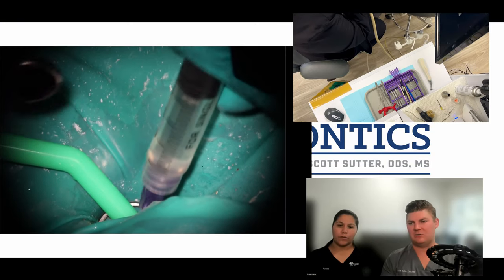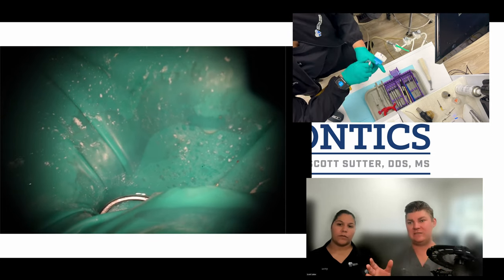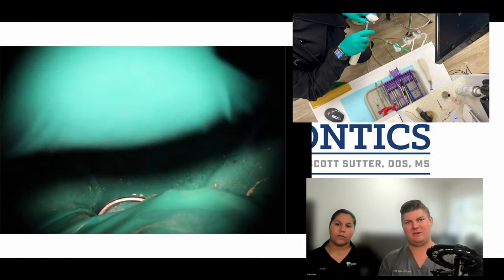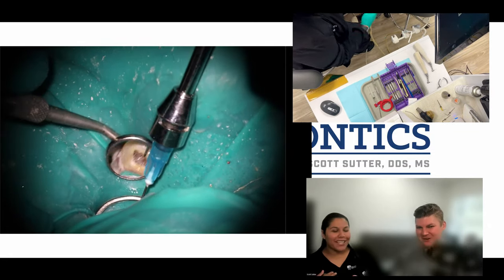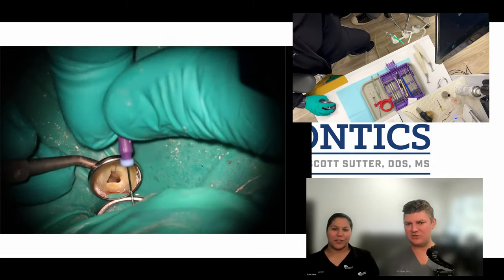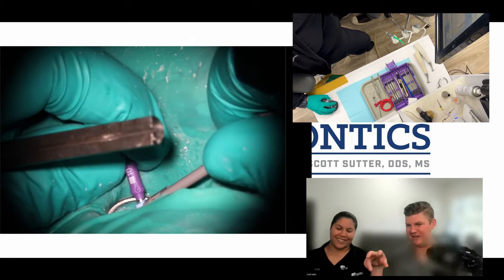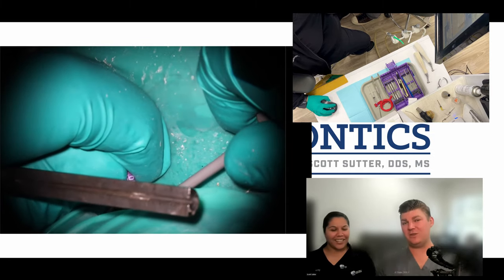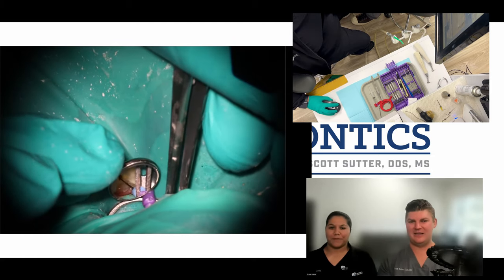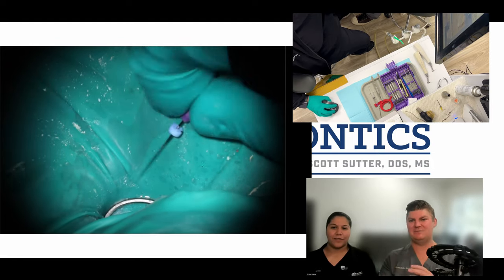Rinse here. You can see the tray hasn't had that much action — pretty stable as far as what we're doing. But now she's putting the suction down, which means we're ready to get length. She really doesn't have to do much during the length portion — she's on the computer most of the time, and that's great, that's why we use TDO. Since she's left-handed, she can pass the forceps with her right hand. It's actually really beneficial to have an assistant with opposite handedness — the left-handed ones make it a lot easier. So I never put the locking forceps down; they stay in my hand until we're completely done.